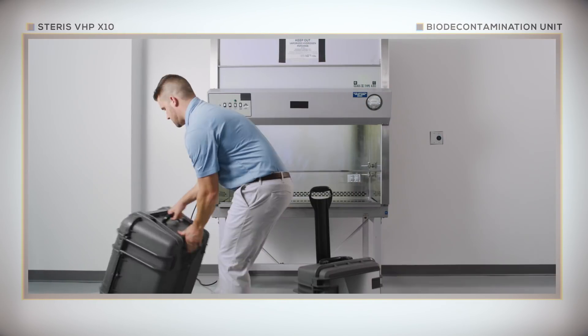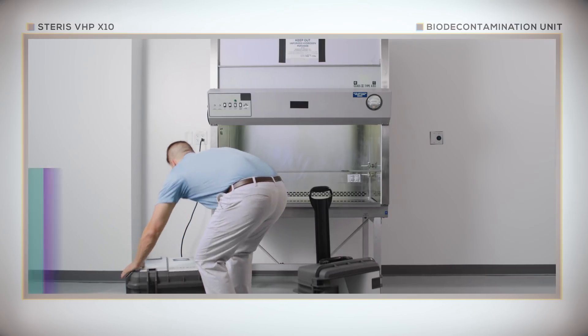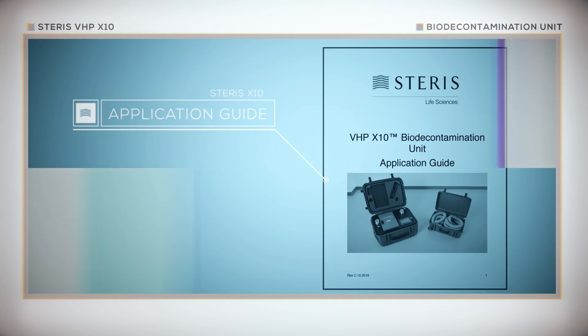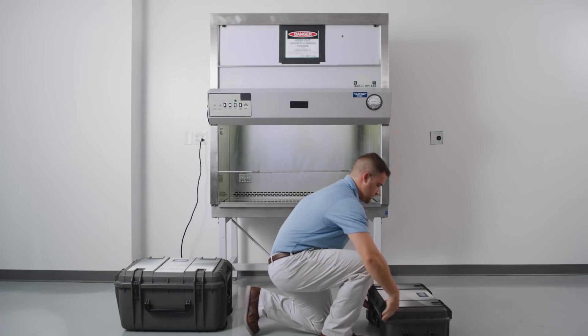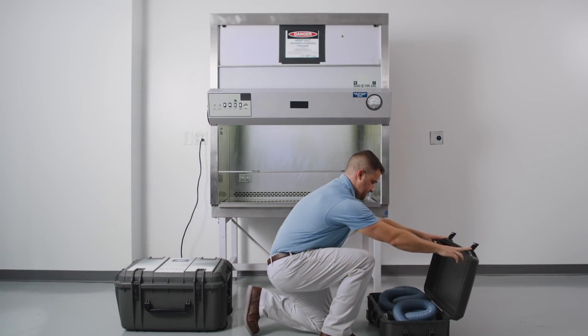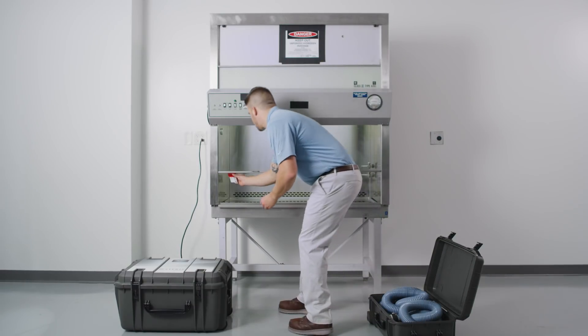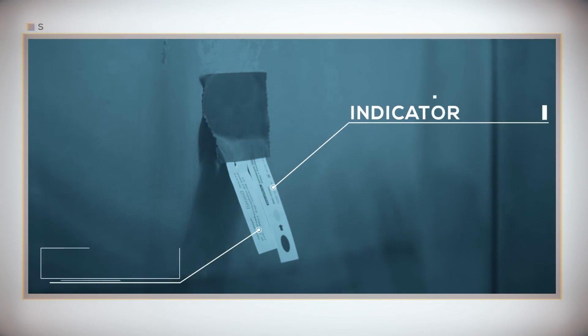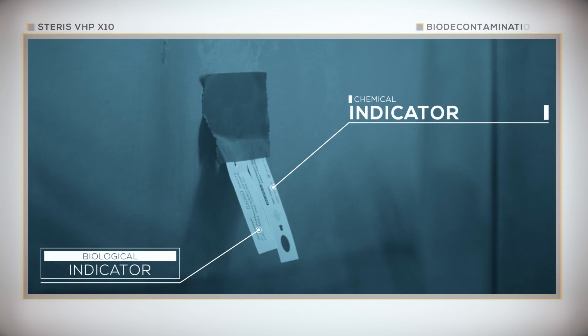We will now review the setup of the X10 unit and biosafety cabinet. Note that the information we are about to present, as well as more troubleshooting tips, are covered in the Steris VHP X10 application guide. Assembling the X10 for operation is simple and straightforward. First, install the optional indicators inside the biological safety cabinet. Indicators can be used to show the presence of H2O2 vapor in the cabinet, while biological indicators can be used to confirm 6-log bio-burden reduction.